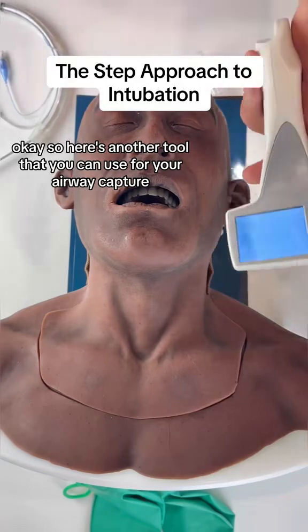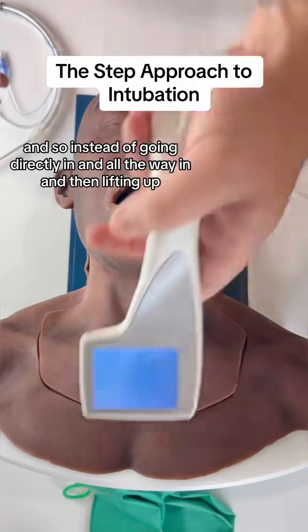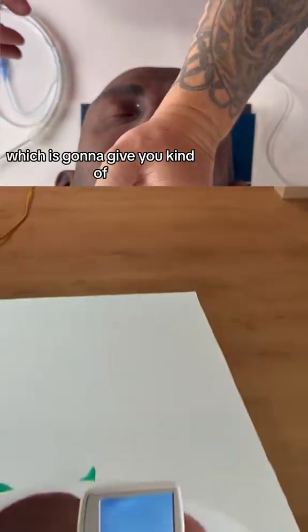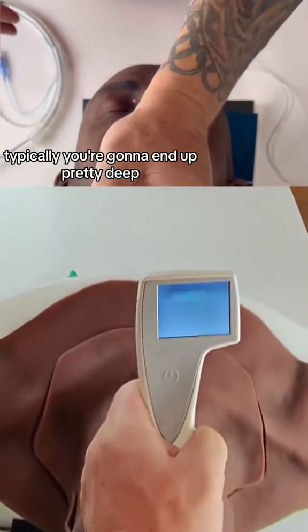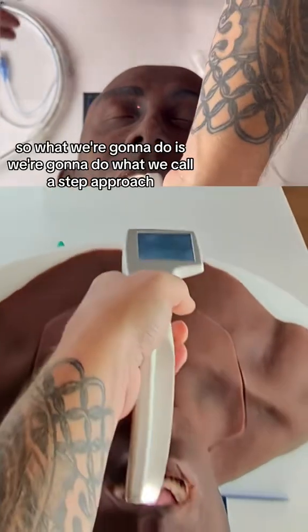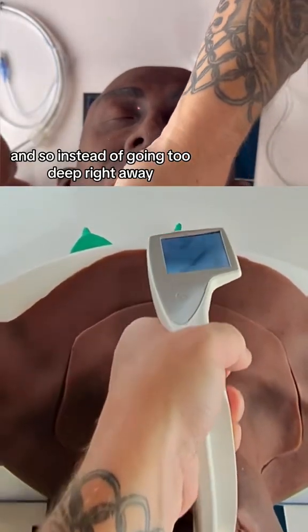Here's another tool you can use for airway capture called the step approach. Instead of going directly in all the way and then lifting up — which typically means you end up too deep and lose track of the anatomy — we're going to use what we call the step approach, avoiding going too deep right away.